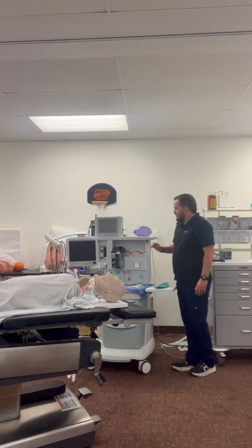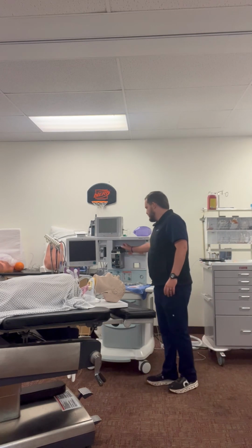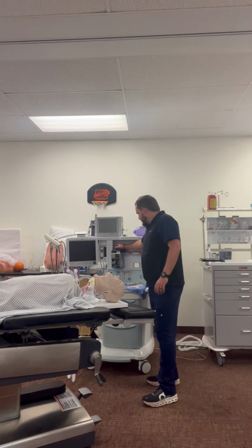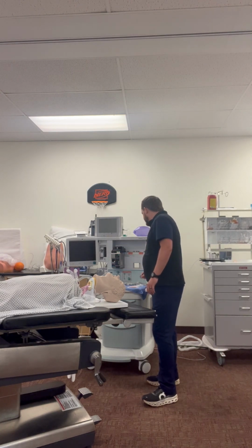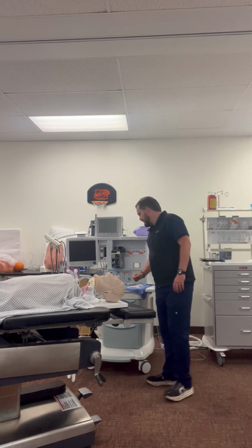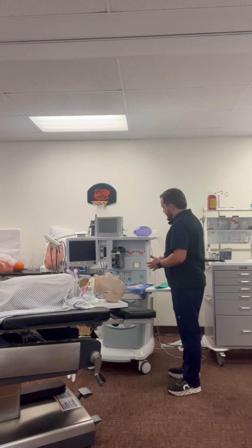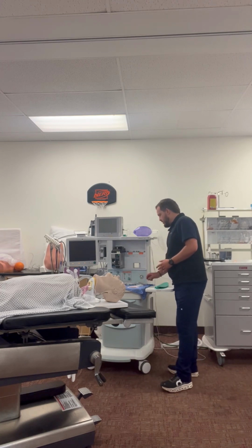I'm going to check and make sure that my sevoflurane, which will be my gas of choice today, is ready to go and filled. I'm going to check the interlock system really quick and perform a low leak test. Once that's done, I'll turn the machine on. While the machine's getting booted up, I'm going to make sure I have all the supplies I need.